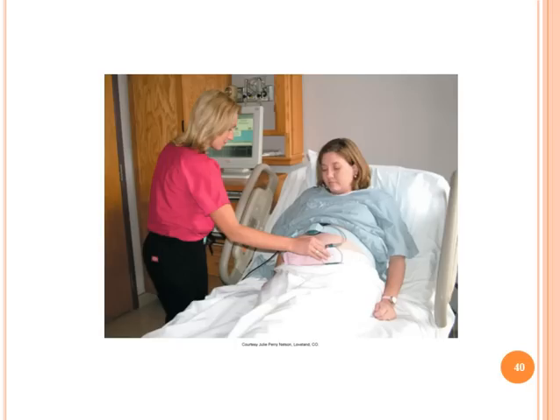And this is figure 15-21 in your textbook, and it just shows the nurse explaining the TOCO and the ultrasound to the patient.